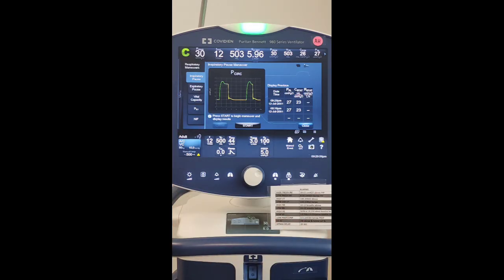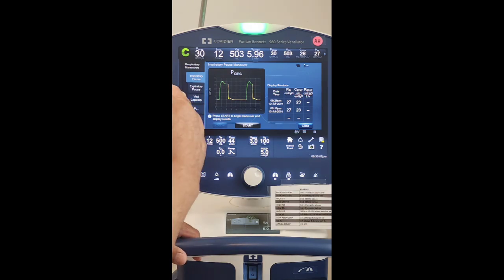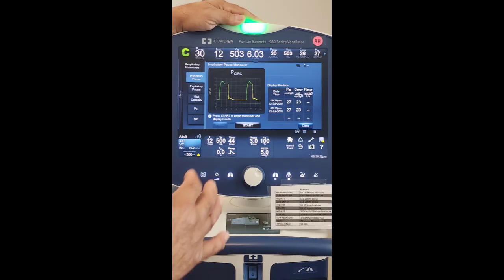You're not going to see much difference. But in a real patient, you will see someone who's got decreased lung compliance. You will see the plateau pressures rising. And in that scenario, we use what I've taught you this morning: when we're switching ACVC to ACPC, we're going to start with a pressure control of the PIP minus 5, or the plateau pressure, 27. Usually the lower number would be better.